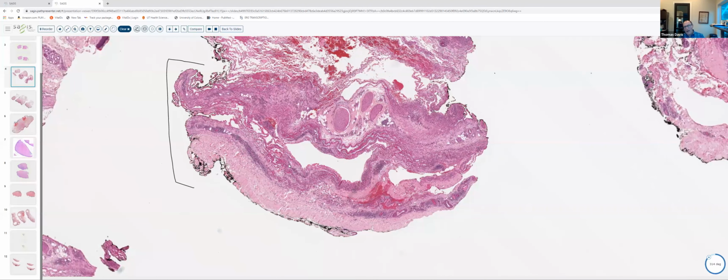Now, this particular biopsy is kind of unique because I would have to say most biopsies of Shulman syndrome or eosinophilic fasciitis that I've seen, I haven't seen eosinophils. The eosinophilia referred to in the name generally refers to peripheral eosinophilia. And of course, this condition is characterized by the sudden onset of edema and pain, firm indurated plaques, usually on an extremity following vigorous exercise. And a lot of people feel that it is within the spectrum of morphea or scleroderma.